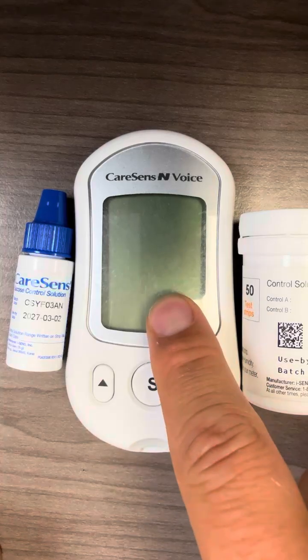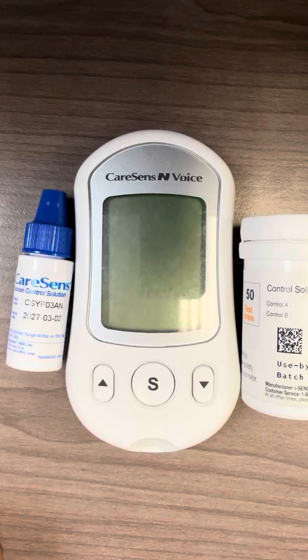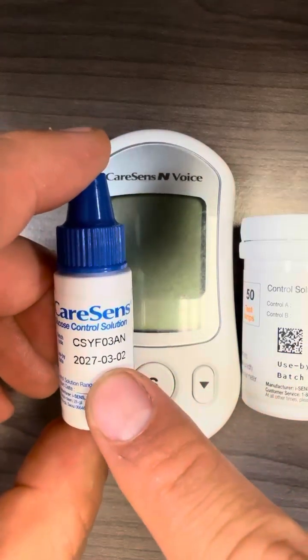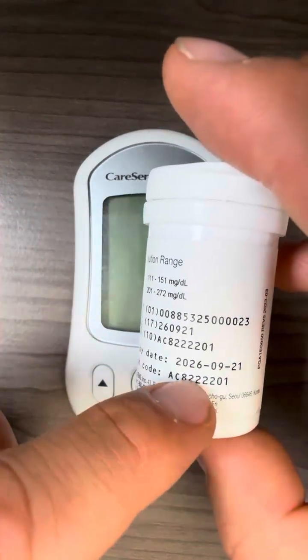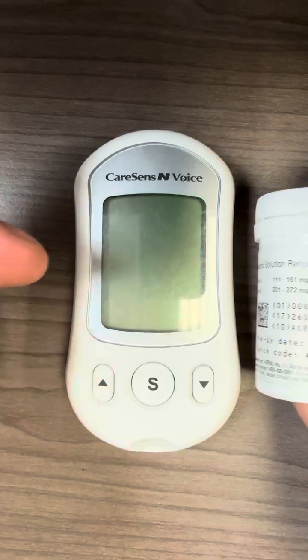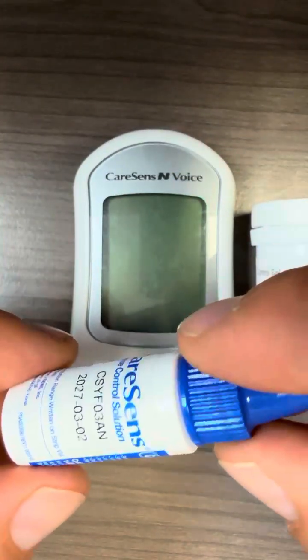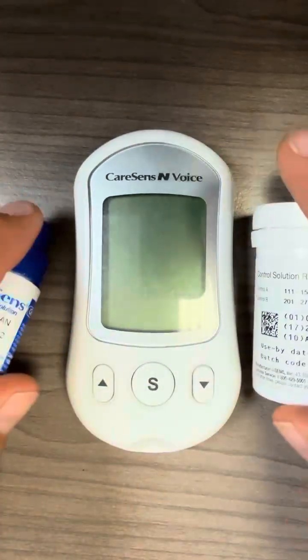First of all, you will need your meter, the test strip vial, and of course control solution. Please ensure that the expiry on both the control solution as well as the test strip is valid. Please keep in mind that once you open this Kerasense control solution to use, from the date of opening it will expire in three months.